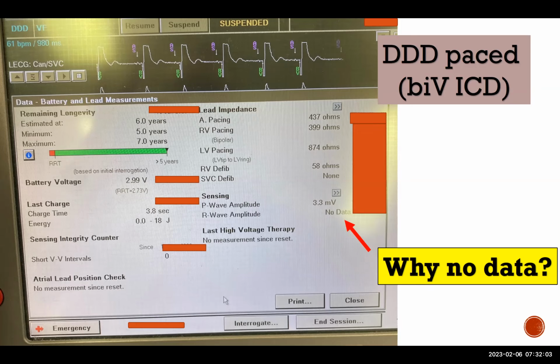What we normally do is set it at the default of the device, which I think in a defibrillator is 0.8 millivolts, something. I believe that's right. Each one is a little different, but it's usually a little less than 1 millivolt for the V, on the assumption that when we put a lead in, we would not accept an R wave that is less than 4 millivolts. Now, in most pacemakers, we set the R wave at maybe 2.2 or 2.8 millivolts, which is a fairly high number of millivolts.